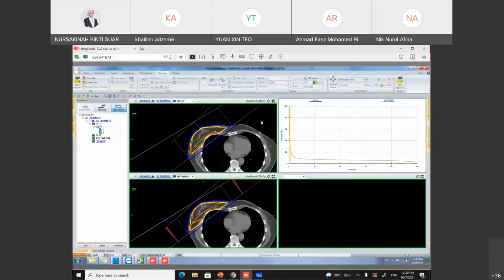You need to remember the patient is coming for 15 fractions, so 15 fractions times half a minute is about 7 minutes, but it definitely reduces patient delivery times and also the whole workflow. Because this patient already saved half a minute, it may reduce the other patients' waiting times too.